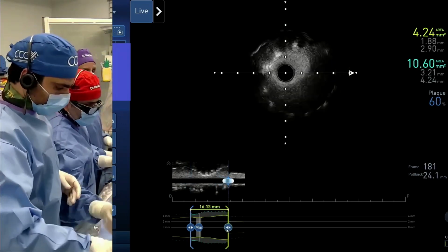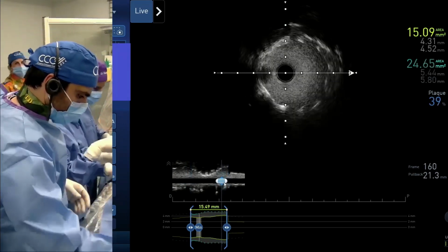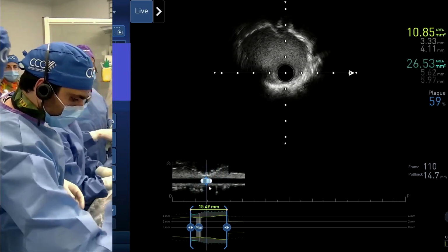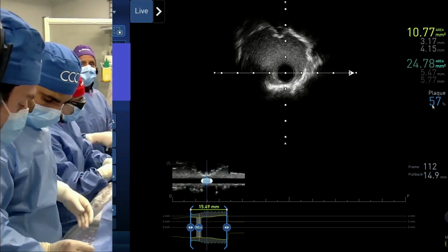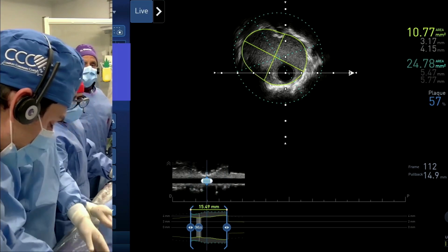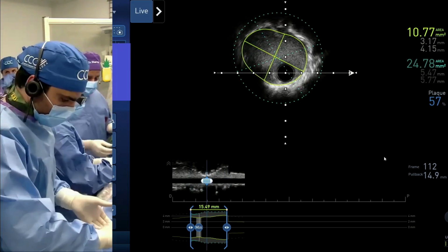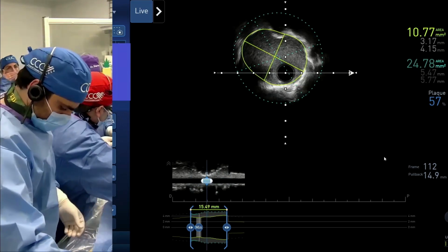And remember, in this case, ostial circ was, as Greg pointed out, the Achilles heel of bifurcation, but it was a very short lesion, as you saw. But here it looks quite good. And we just need to do a little 5-4 proximal POT, and the lumen is terrific. Looks very good. Terrific. Dr. Mehta.